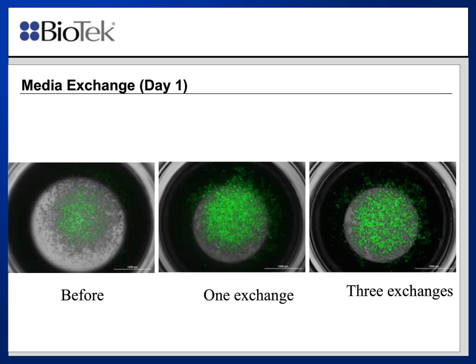Media exchange can also be evaluated. On day 1 here we show before on the left side of the slide, and then after 1 exchange we can see we get rid of some of the background and cells that may not have aggregated. And then after 3 exchanges, we see we still have excellent retention of our cells.